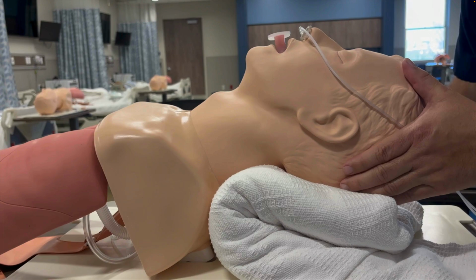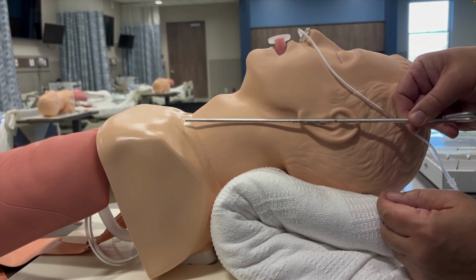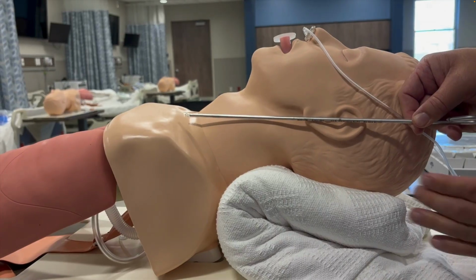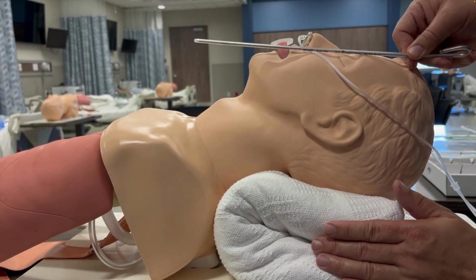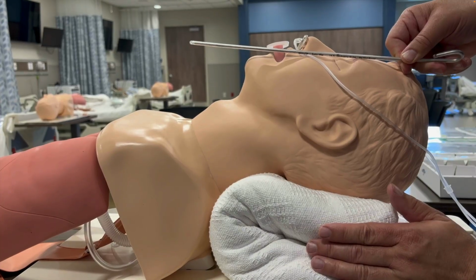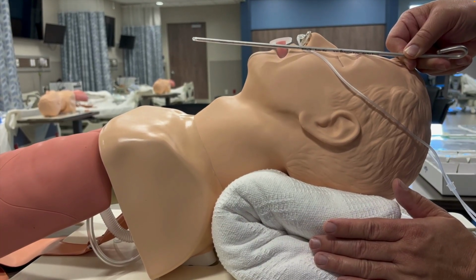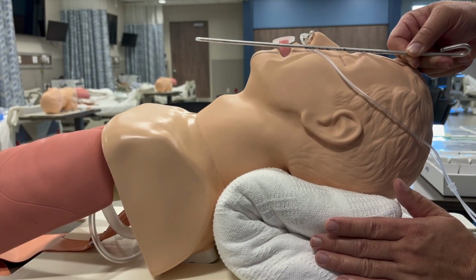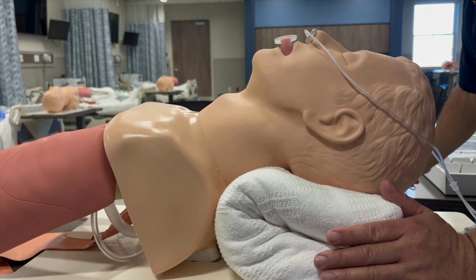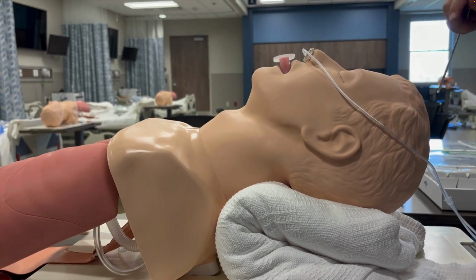So if you'll notice here, you'll see that the ear to sternal notch structure is now parallel to the ceiling, and the face plane is also relatively parallel to the ceiling. This is a good position for the patient to be in to align all the airway axes for optimal visualization of the glottic opening.